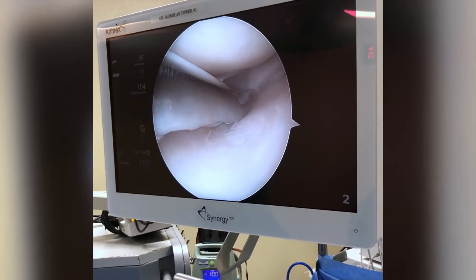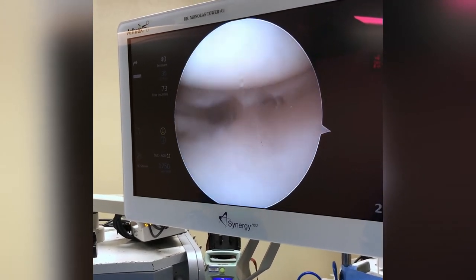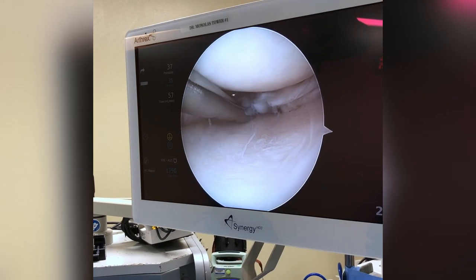He's a little tight, so we've got to open that knee up a little bit. My physician assistant is giving me some assistance so I can see inside the knee better.